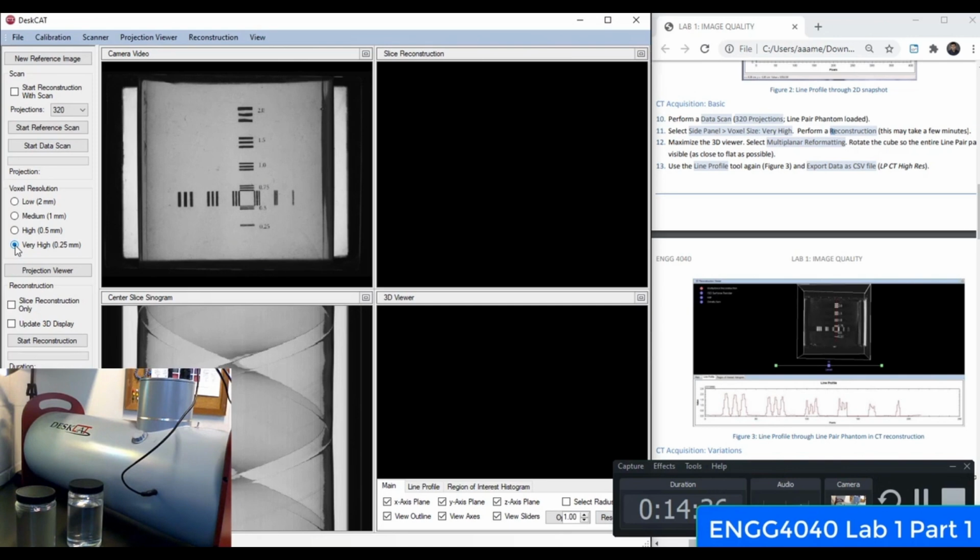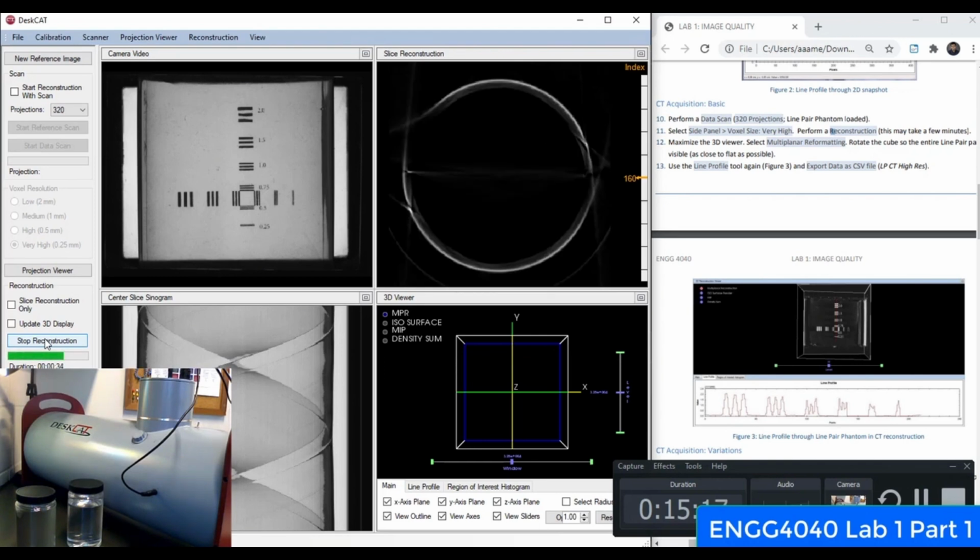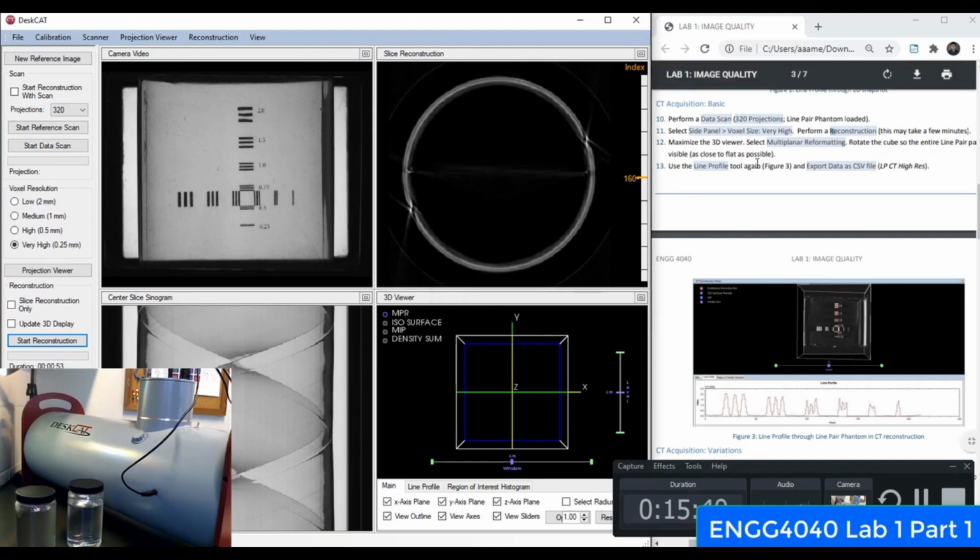Perform a reconstruction. Excellent. That's complete.